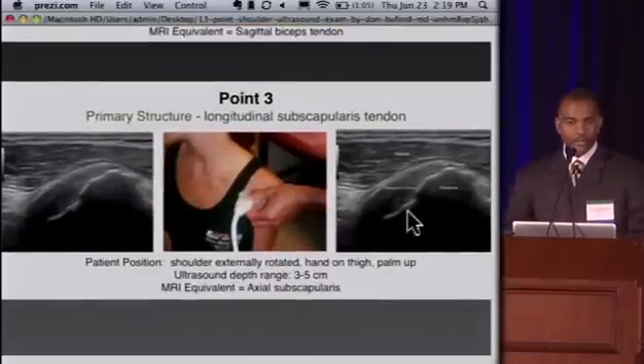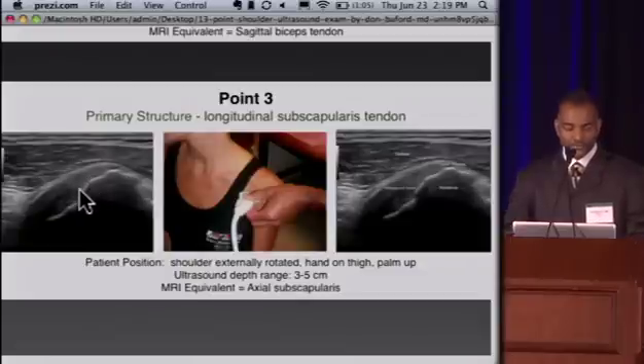At point three, now that we've seen the biceps in two planes, we move on to the subscapularis tendon. The patient's arm is externally rotated with the elbow by her side, fully externally rotated. The reason we do that is to put the subscap on stretch, which gives us maximal diagnostic sensitivity for looking at small subscap tears. Here's the lesser tuberosity, which is the insertion for the subscap. The superior border of the subscap is this white line, and above that is deltoid.